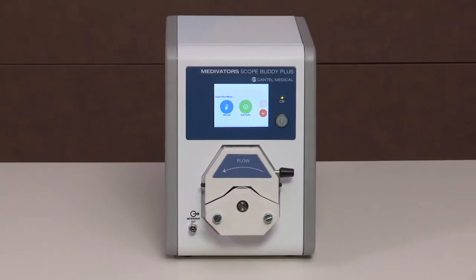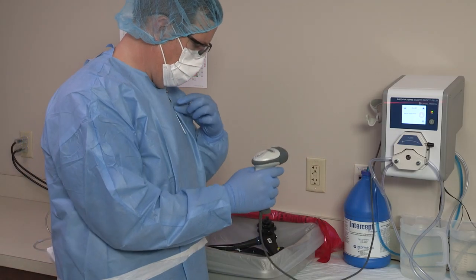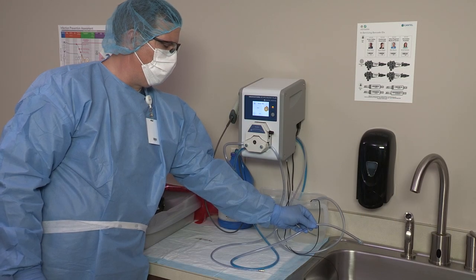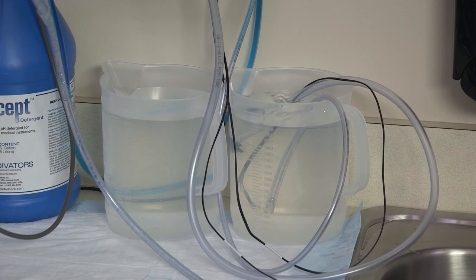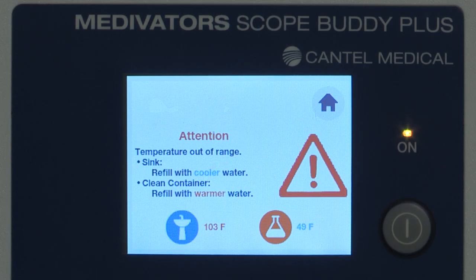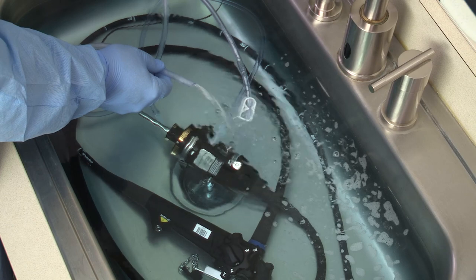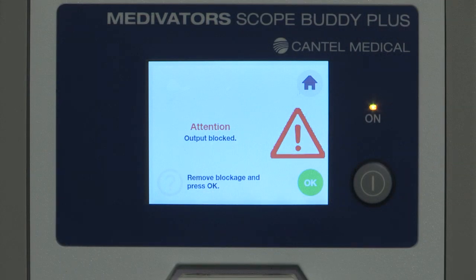The Scope Buddy Plus Flushing Aid is designed to facilitate the flushing of fluids through the internal channels of flexible, immersible endoscopes during the manual cleaning step of endoscope reprocessing and prior to high-level disinfection. This device has been designed and tested to meet or exceed endoscope manufacturer's requirements for fluid delivery. It provides detergent dosing, monitors the temperature of the sink or clean container solution, and alerts the user when the solution temperature is not within the acceptable range. Fluid pressure monitoring in the endoscope channels is provided to ensure the manufacturer's specifications are not exceeded, and can also potentially indicate an obstruction in the endoscope.